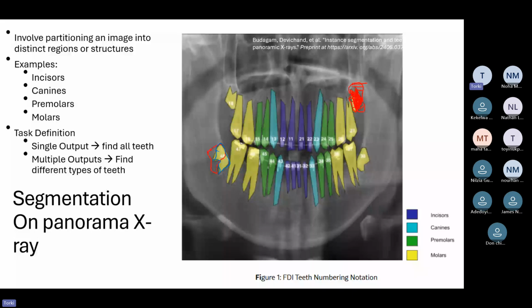You compute this one, you find the distance is equal to 0. You compute this one, you find the distance is 0. But for this one, the closest point is too far away. So you find the closest points to every point on the red curve and rank them. For the 95th percentile, you are not taking the minimum or the maximum.